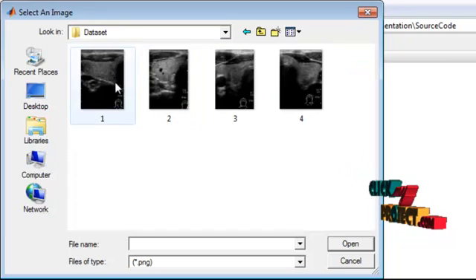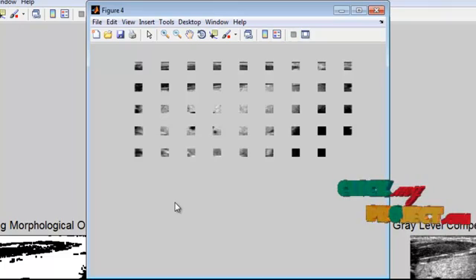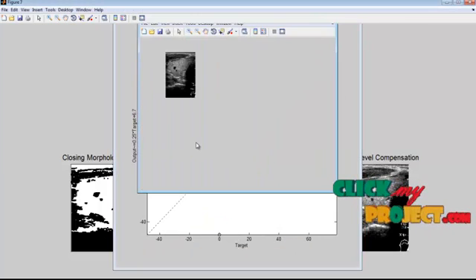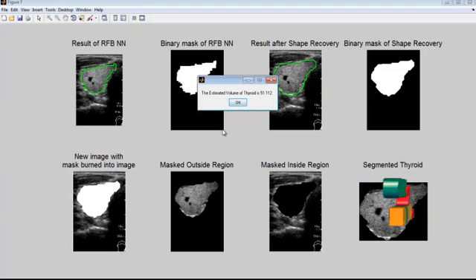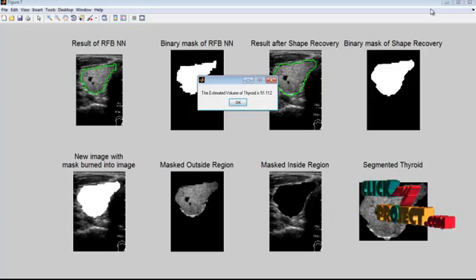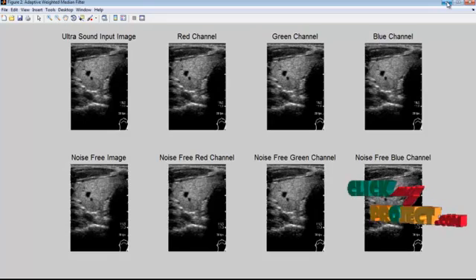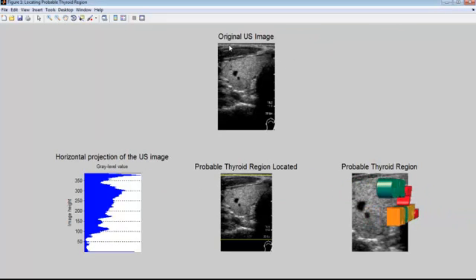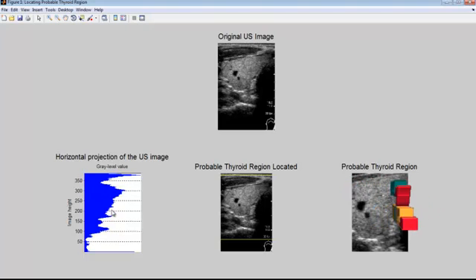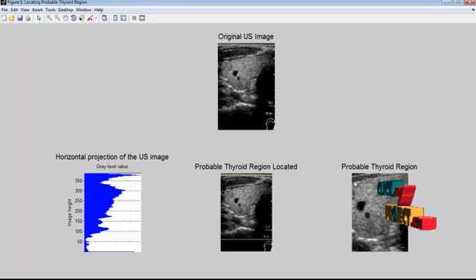Select any image from the image dataset and click the Open button. The estimated volume of the thyroid is 51.112. This is the original ultrasound image provided as input. These are the horizontal projections of the ultrasound image, and we have located the probable thyroid region and enhanced it.